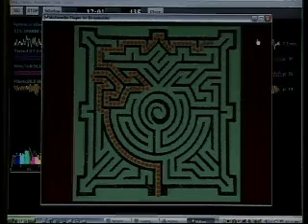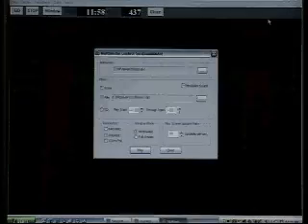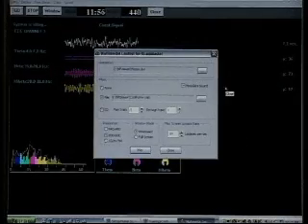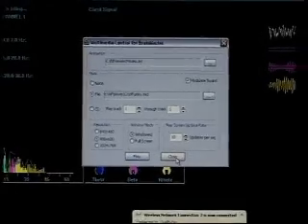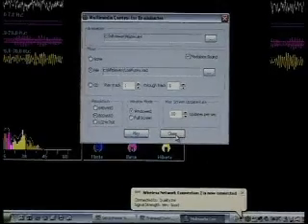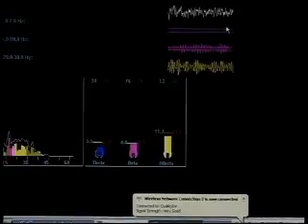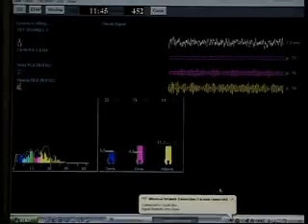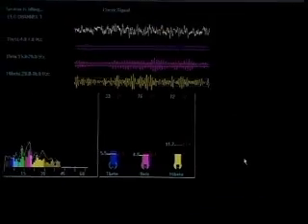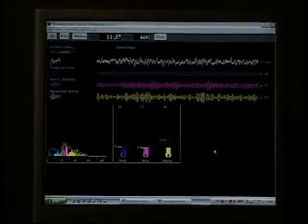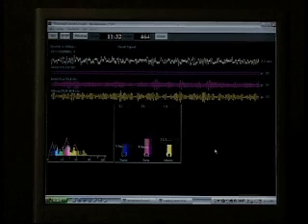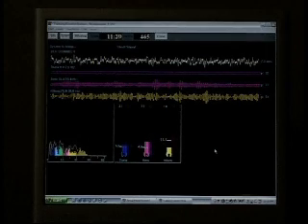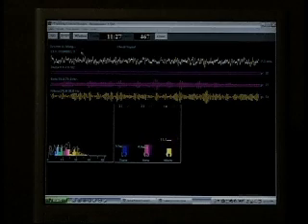Again, just a different option. We can go ahead and close that. Then to close the MMP player, we can either use the close button in the lower part of the box, or we can simply close from the red X. We want to be sure that we do not have multiple versions of the MMP running simultaneously because it would be a little too strenuous on the PC. And again, you may either stall the program, freeze the program, or simply the feedback would run behind.